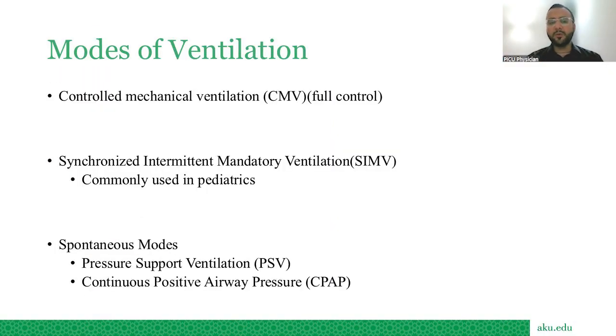Now, coming to the modes of ventilation. This slide is very simple, and I've tried to make it very simple just for the understanding of all of you. So, three basic modes of ventilation.